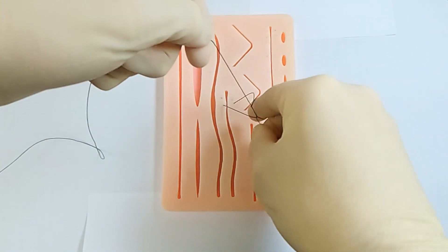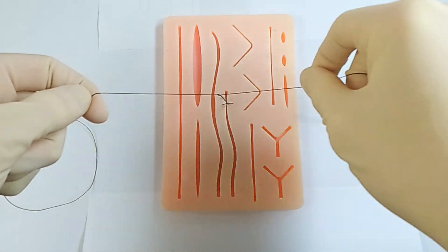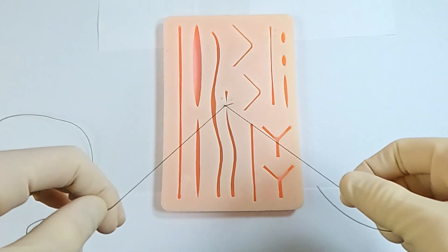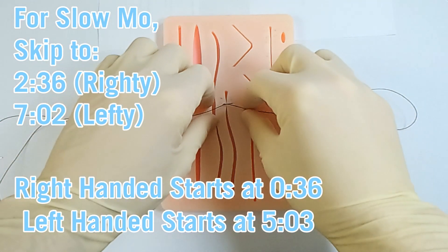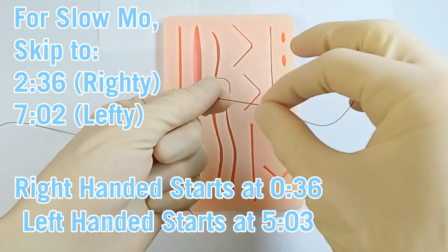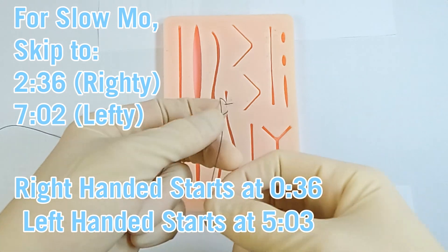What's up you guys, Rex here. I'll be going over a one-handed tie because I haven't found a quality tutorial showing how to tie with gloves from a surgeon's point of view in slow motion. I'll be breaking this video into two parts: right-handed starting at 36 seconds, and left-handed showing the same thing mirrored for lefties starting at five minutes and three seconds.